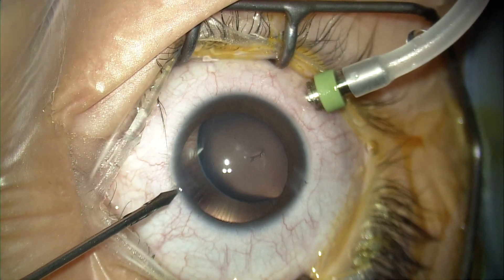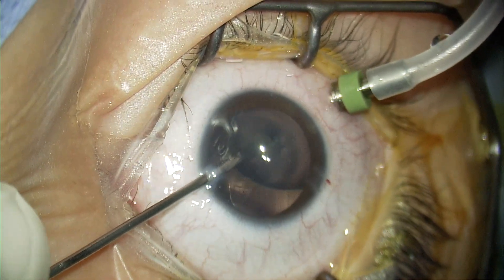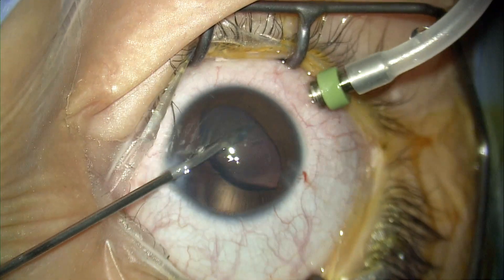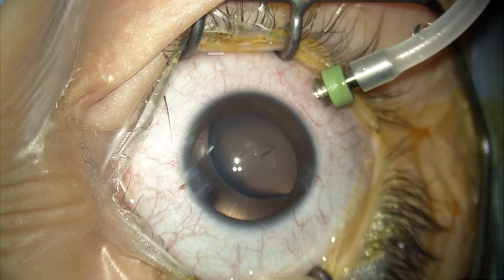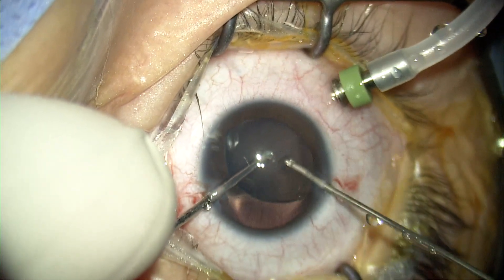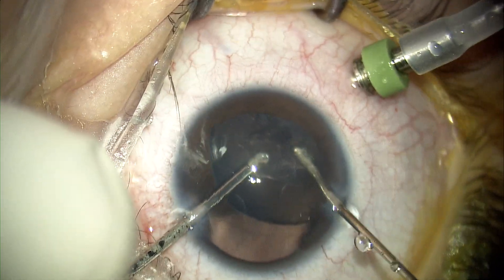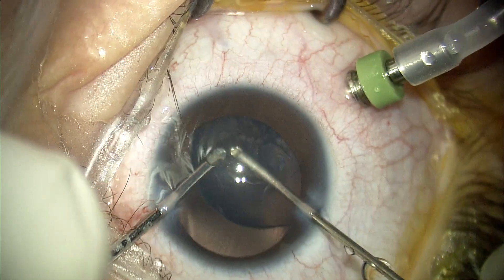The way I did my lensectomy is not through the pars plana approach — I did it through an anterior or corneal approach. As you can see, I pierced the anterior capsule of the subluxated crystalline lens using an MVR blade, creating two openings in the anterior capsule, through which I will put my irrigation and use the vitreous cutter to cut and aspirate the subluxated crystalline lens.